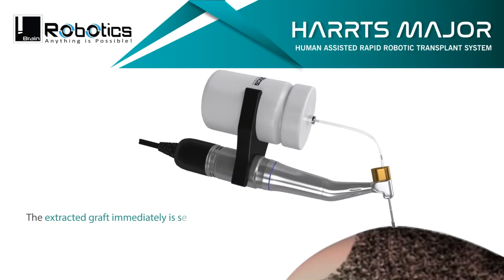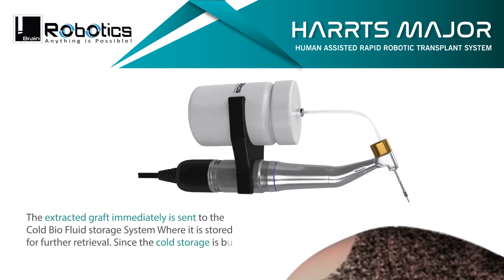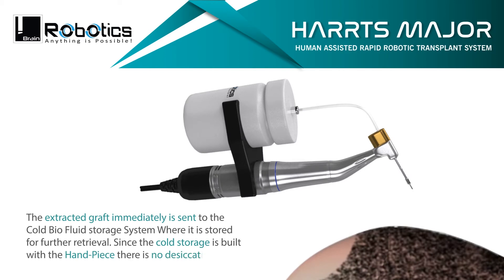The extracted graft is immediately sent to the cold bio fluid storage system where it is stored for further retrieval. Since the cold storage is built with the handpiece, there is no desiccation of the grafts while traversing.